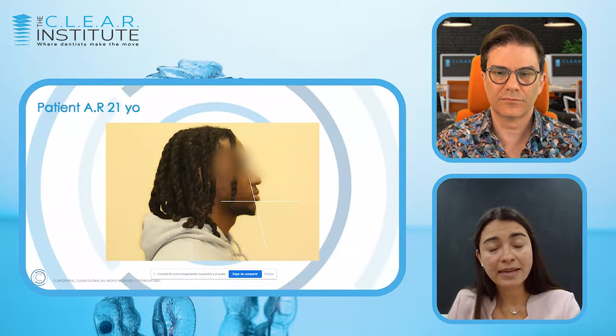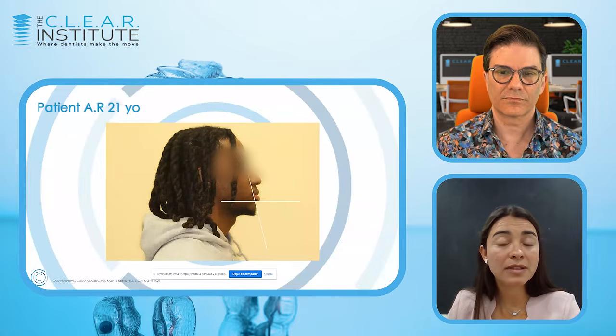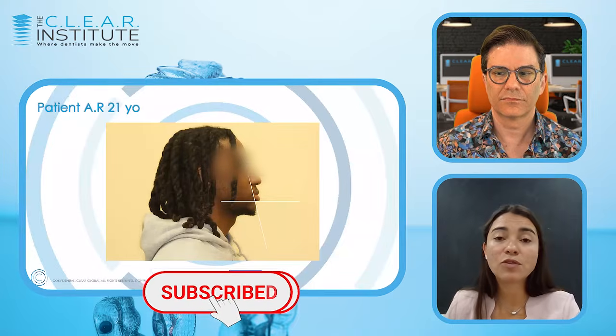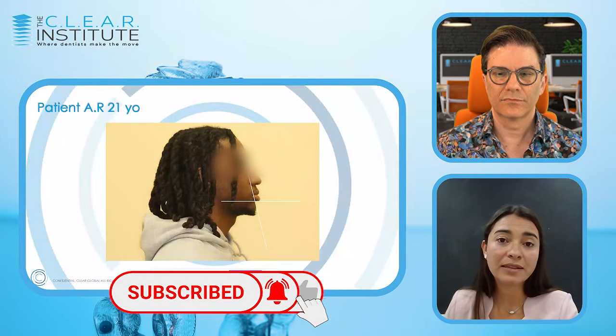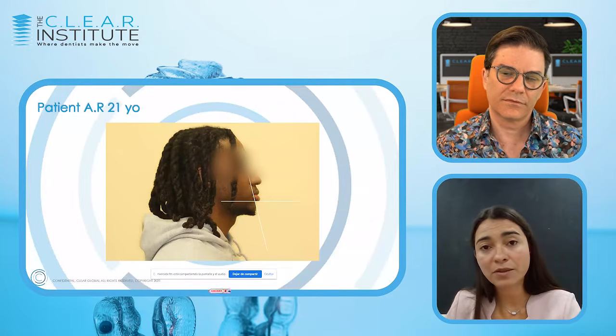And I say again, it's always better to have a cephalometric x-ray, but remember that the angle formed between the lower incisors and the mandibular plane tells you how much you can procline or retract the lower incisors. Yeah. And that's what forms this angle.